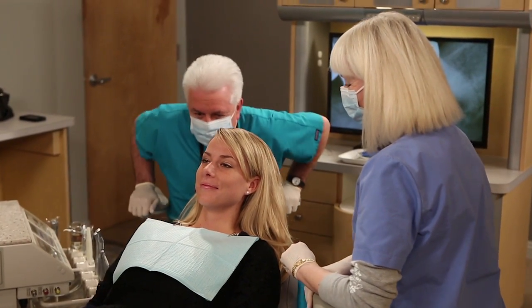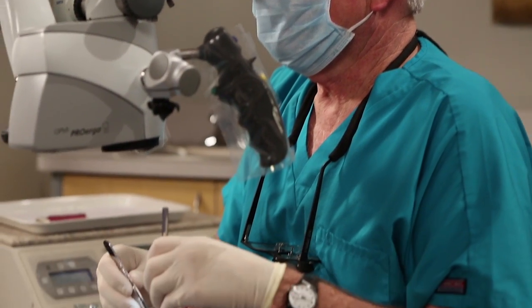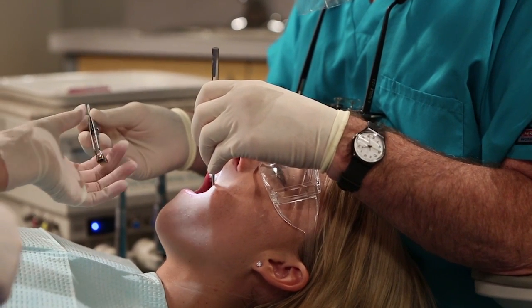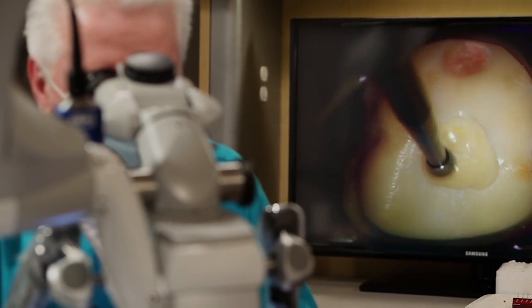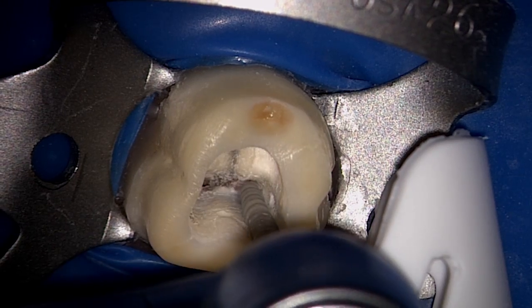Let's get started. As we might expect from the preoperative film, access could be difficult through this prosthesis, and so in this instance, we elected to go ahead and remove the bridge. I want to emphasize the importance of straight-line access to each orifice. Certainly, the internal walls of any access cavity should be flared, flattened, and finished.